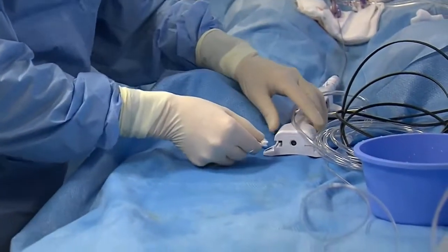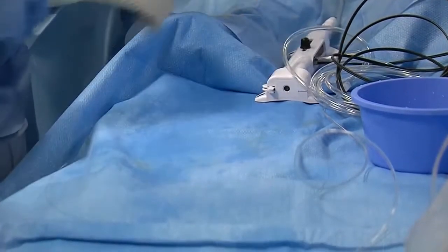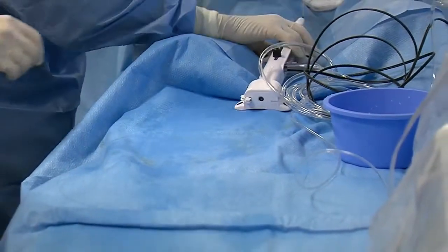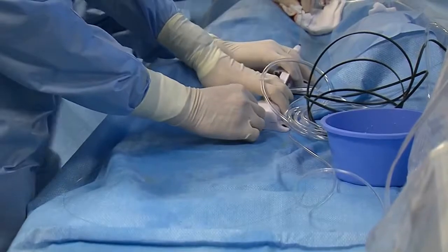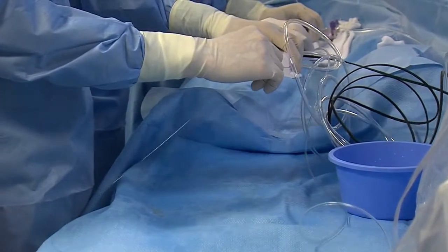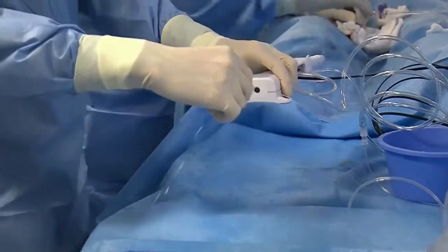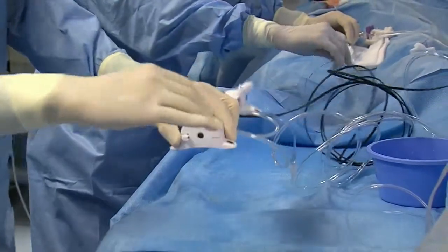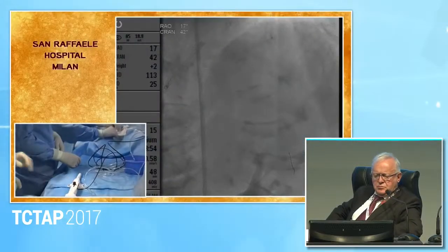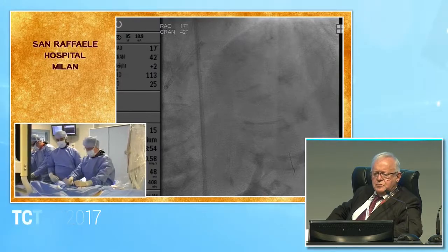We make a loop, we open the brake, we have a large loop here. We go in Dynaglide, and basically it's nothing particular except you don't really need to hold anything. And we come back on Dynaglide, and everything comes automatic. Stop. Okay, that's it. So now you can remove the brake and remove everything.